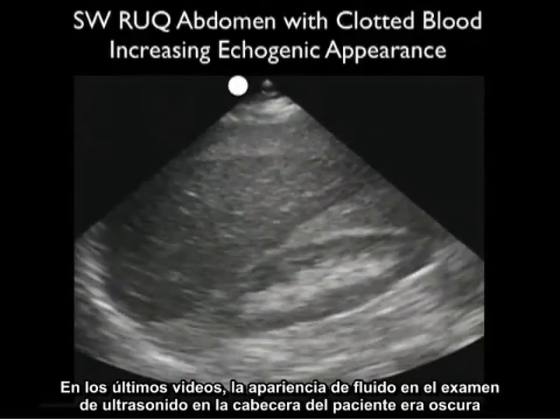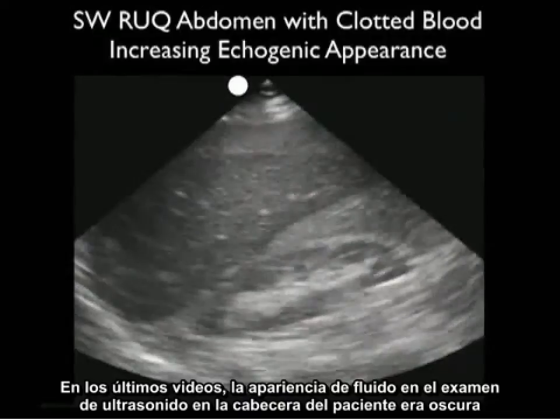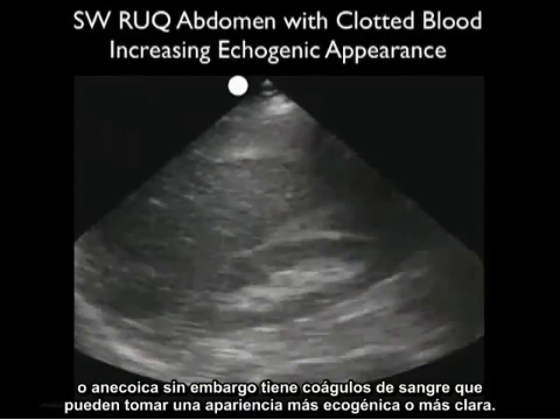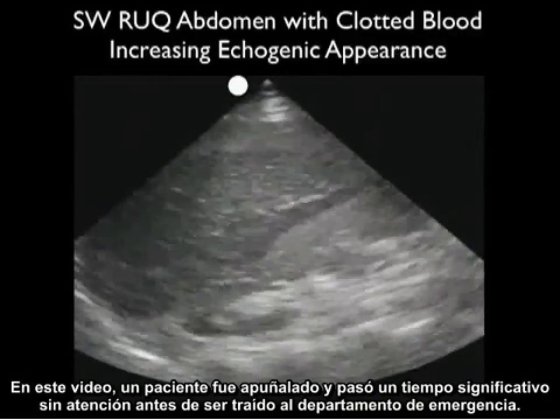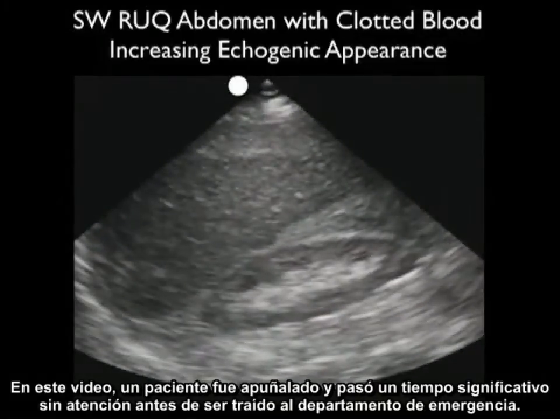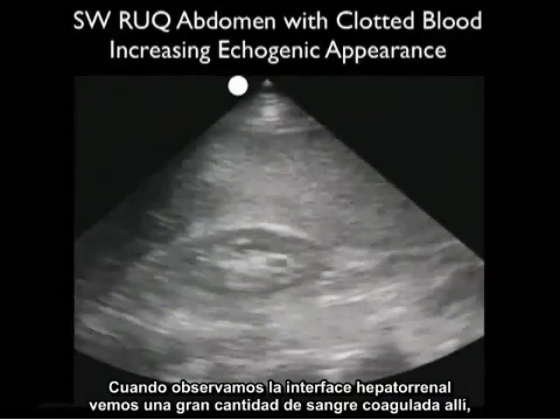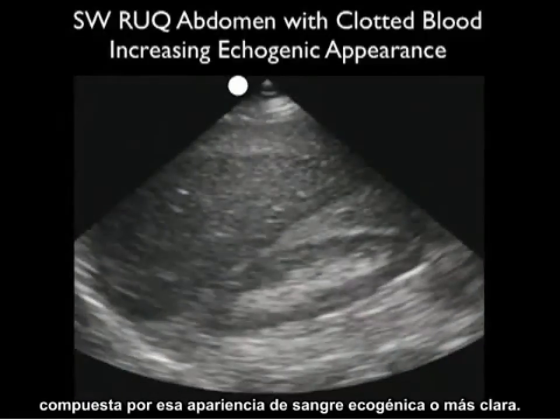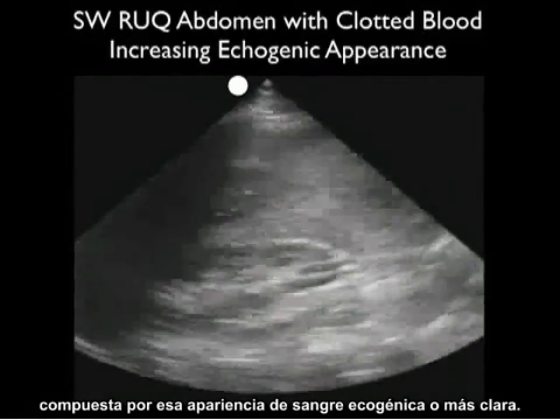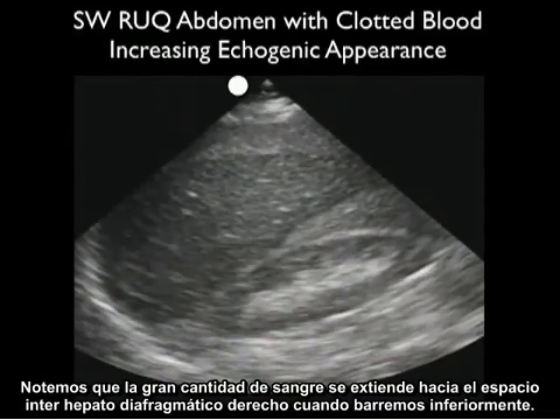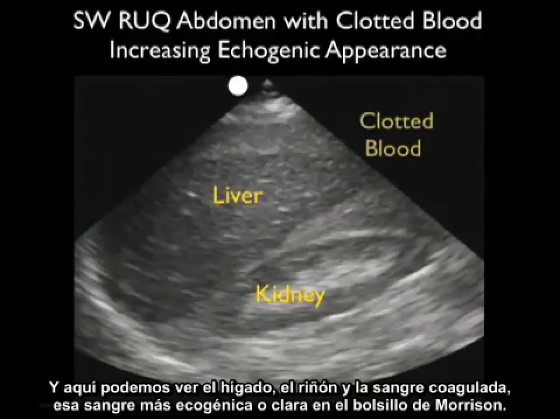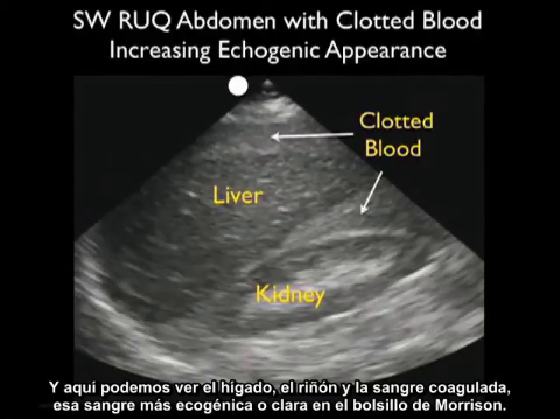In the last few video clips, fresh fluid on bedside sonography appeared dark or anechoic. However, as blood clots, it can take on a more echogenic or lighter appearance. In this video clip, a patient was stabbed and had significant downtime before reaching the emergency department. As we look at the hepatorenal interface, we see a large amount of clotted blood with that echogenic or lighter appearance. Notice that the large amount of blood extends into the right pericolic gutter as we scan inferiorly, where we can see the liver, the kidney, and the clotted blood — that more echogenic, lighter blood — in Morrison's pouch.